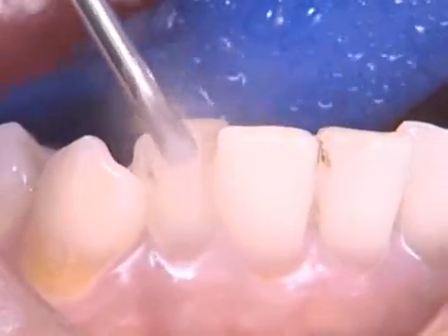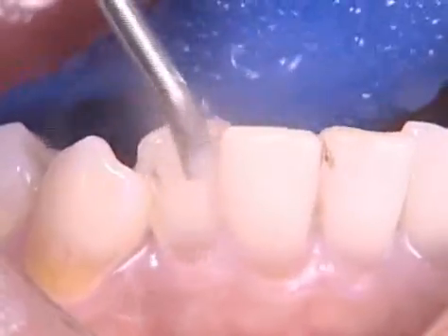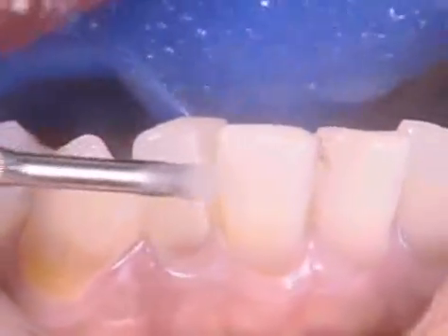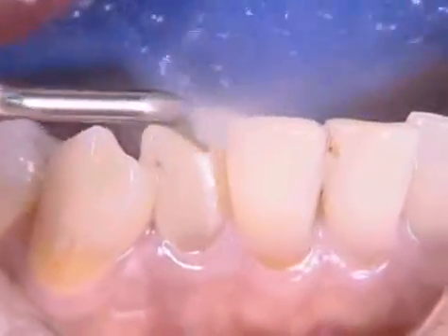Ultrasonic scaling has the advantage of quick, extensive stain removal. Copious irrigation is recommended. Water cooling prevents heat generation of the tip.